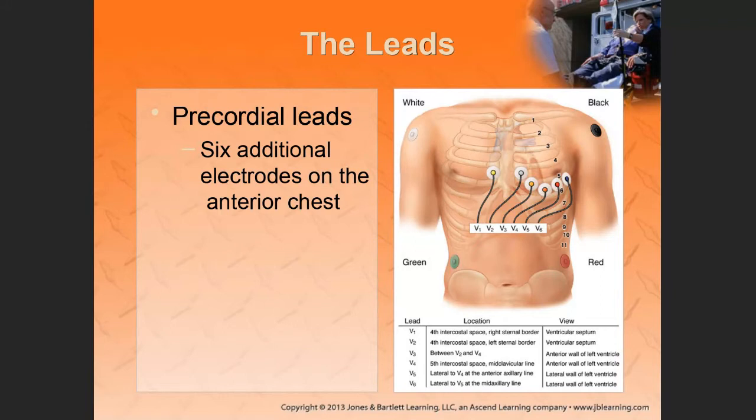Note that the majority of the leads tend to look at the left side of the heart. That's the side of the heart that is prone to heart attacks. Doesn't mean that a patient can't get a right side heart attack or a posterior or an inferior heart attack. But heart attacks are common on the left side. So that's your leads. That's what you need to learn, because you will see it again when you meet me face to face.